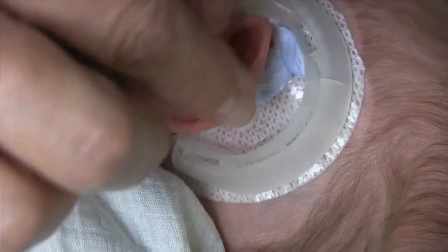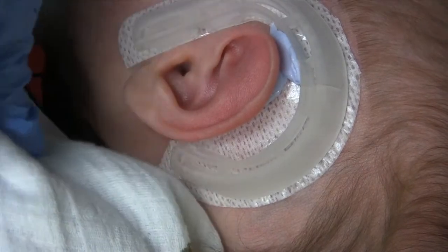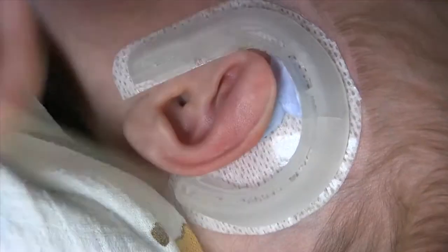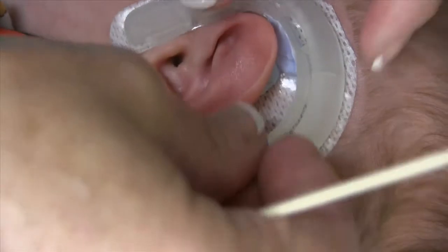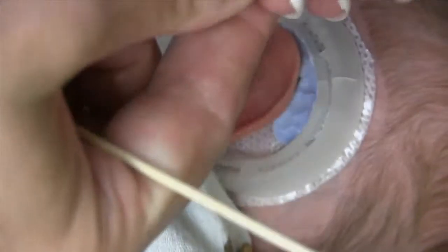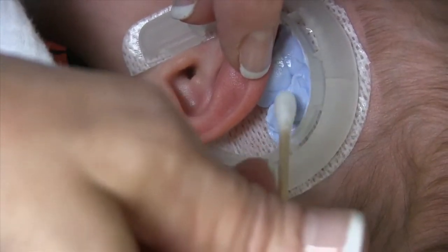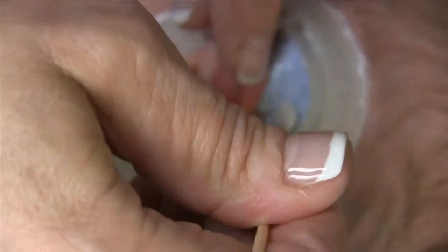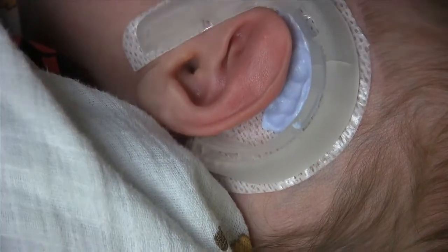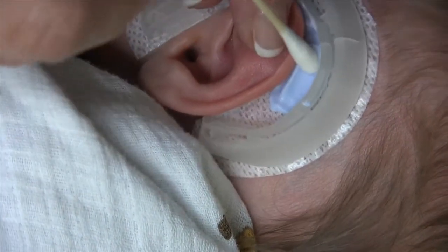Then I work it up here at the top too so I can get that to bring that in — see how that's happening there. You can also use a cotton swab. This is very forgivable material. You have several minutes to get this to start working so that we can get this curled in.